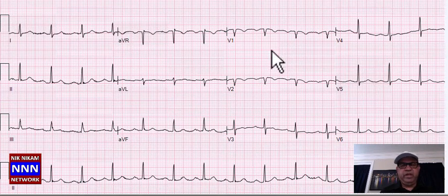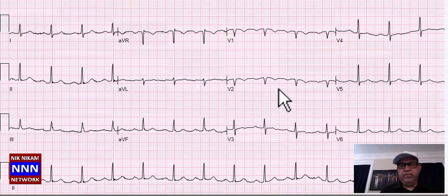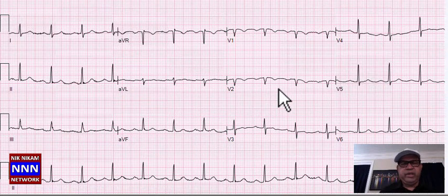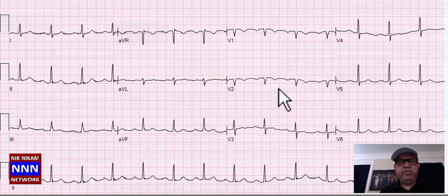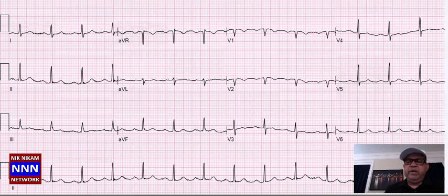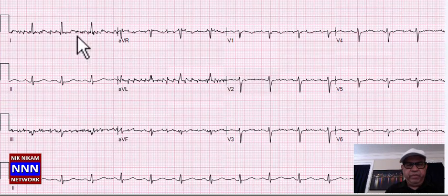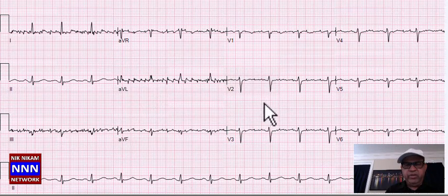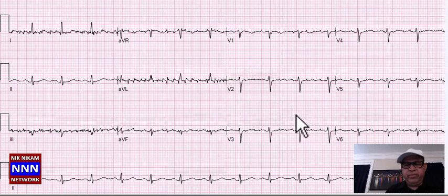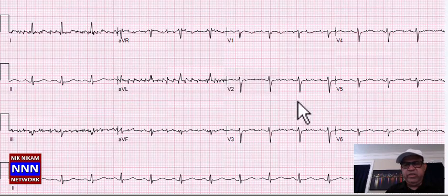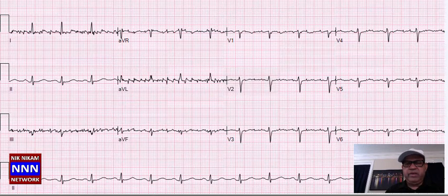We have sinus rhythm. Loss of R-waves in V1 and V2 with non-specific ST-T changes — consider possible anteroseptal myocardial infarction. Sinus rhythm with baseline artifacts, 60-cycle artifact, non-specific ST-T changes — and that's about it.